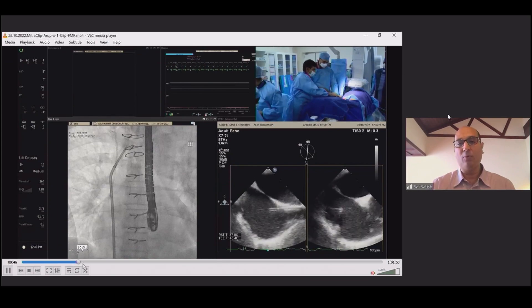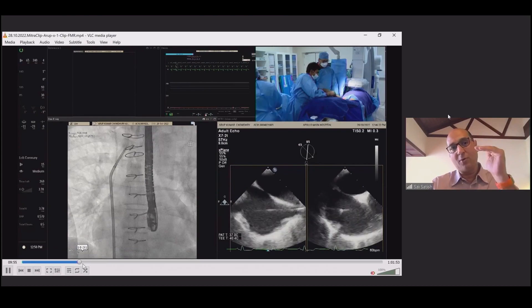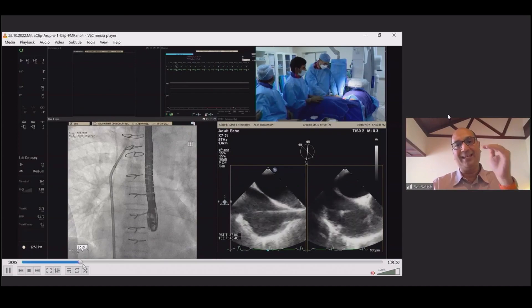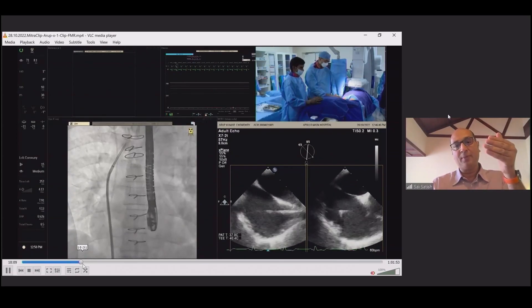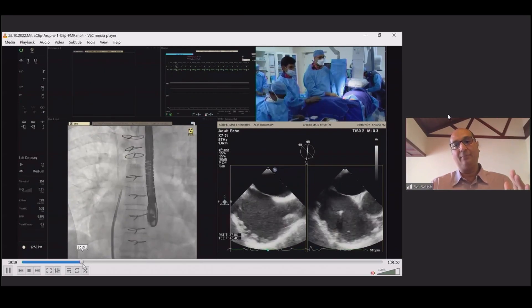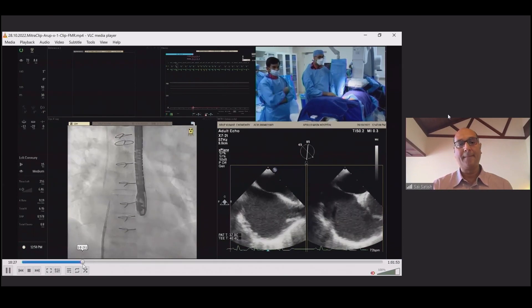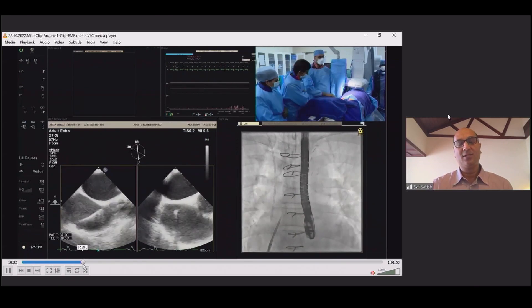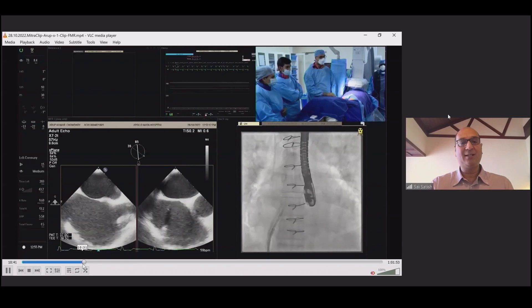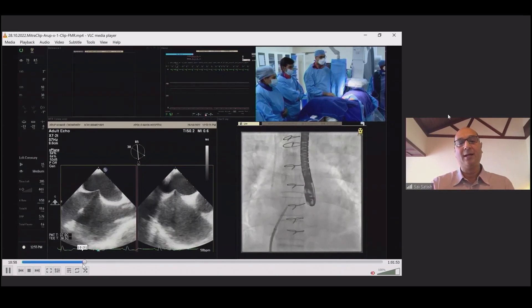From the SVC pull-down, what I like and am quite used to: for MitraClip I want to get the puncture posterior and superior. Now, you're most coaxial to the valve plane the more inferior you come, but that's at a trade-off of height — and for us to maneuver the MitraClip comfortably we need at least 3.8–4.0 cm. As I'm coming down I turn clockwise, which flips my needle posterior, and I come down to the nice thin part of the septum. You can see the needle come down nicely on both fluoro and echo. Once I start this procedure my priority is echo — I flip the fluoro away and bring the echo right in front of me. I'm in the thick part of the septum coming down to the thin part, nice and posterior.